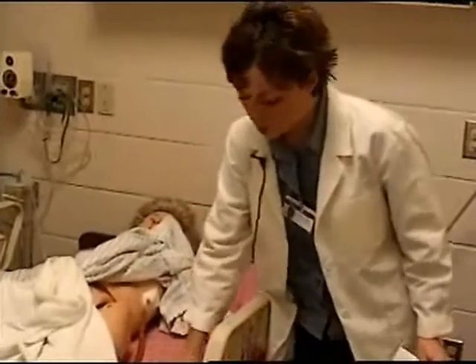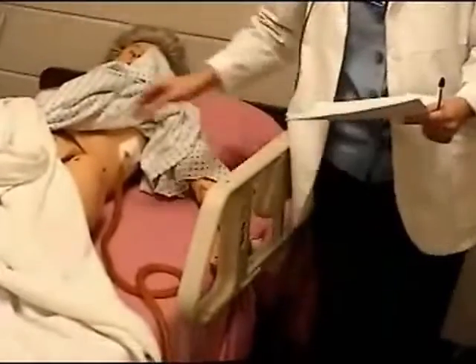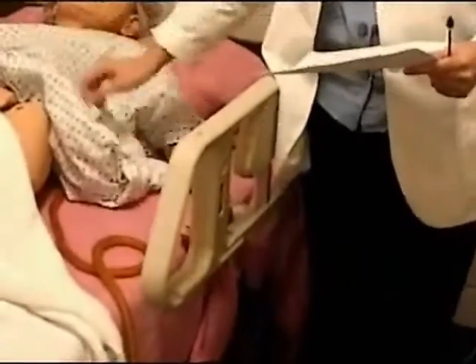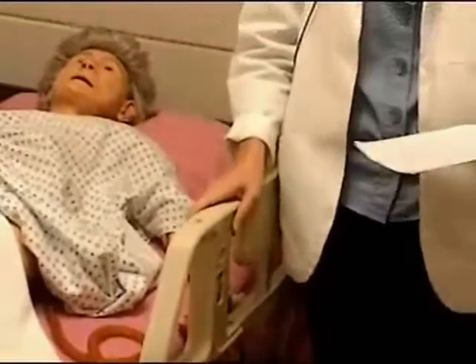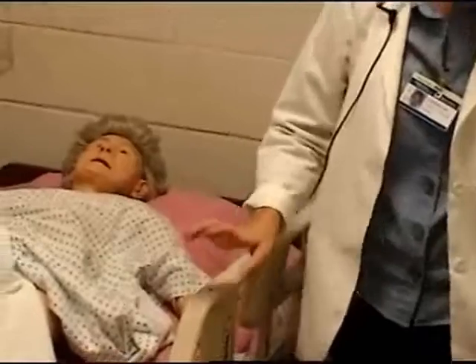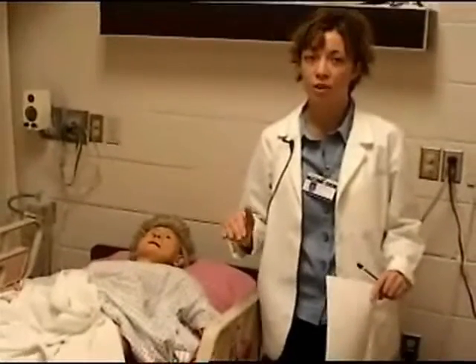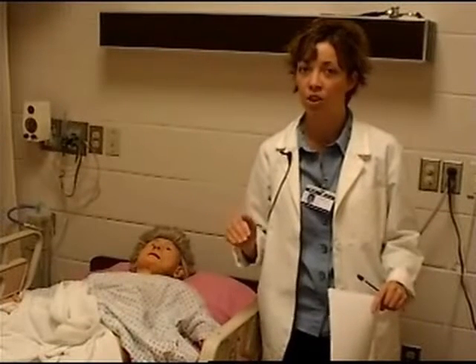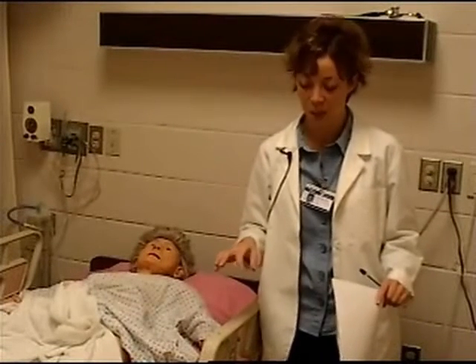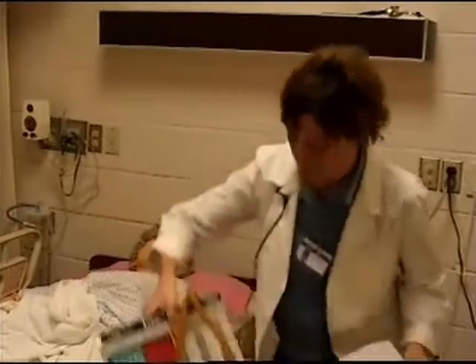Are all of the tubes free of kinks? You don't want any kinking. You want the suction to be hooked on properly. Clamps, if there's any clamps, they need to be open. We need to look at the amount of drainage, how much they're putting out. When we're first doing it hourly, then you need to document hourly how much drainage there's coming from that chest tube.